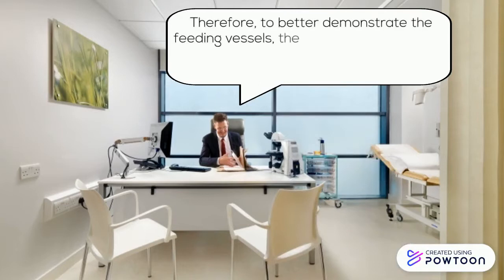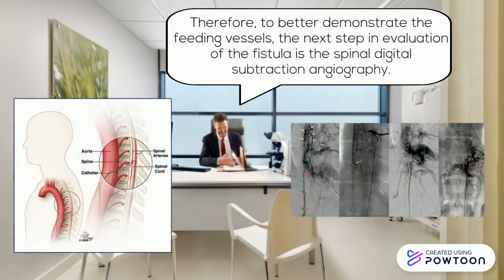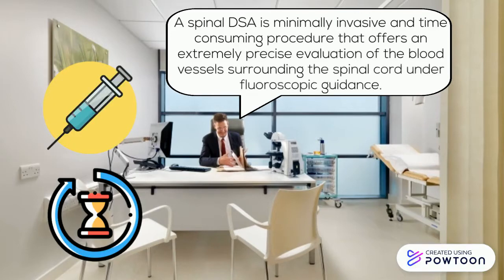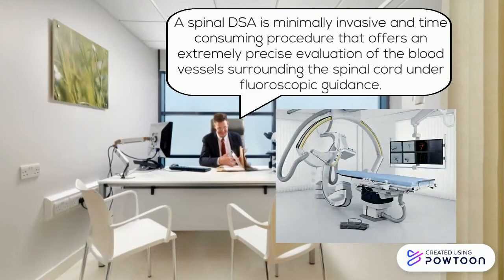Therefore, to better demonstrate the feeding vessels, the next step in evaluation of the fistula is the spinal digital subtraction angiography. A spinal DSA is a minimally invasive and time-consuming procedure that offers an extremely precise evaluation of the blood vessels surrounding the spinal cord under fluoroscopic guidance.